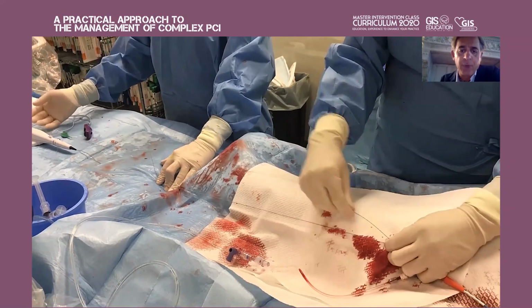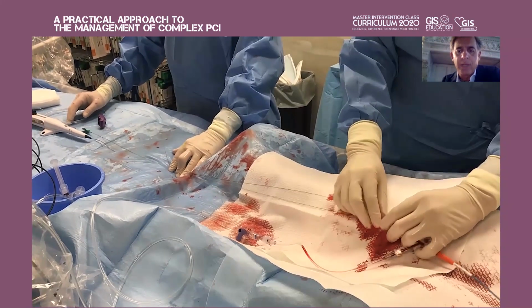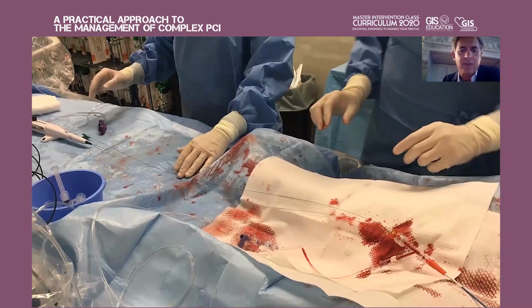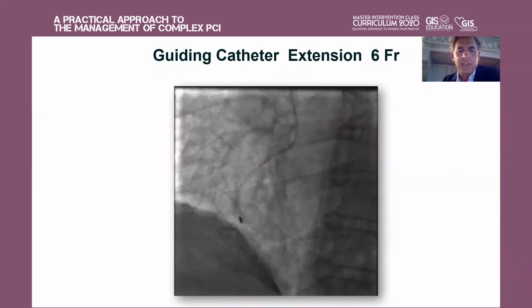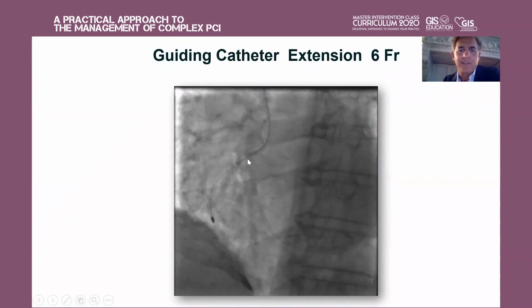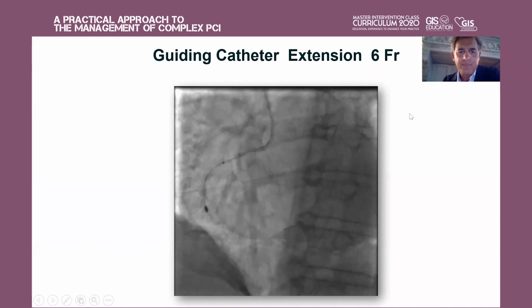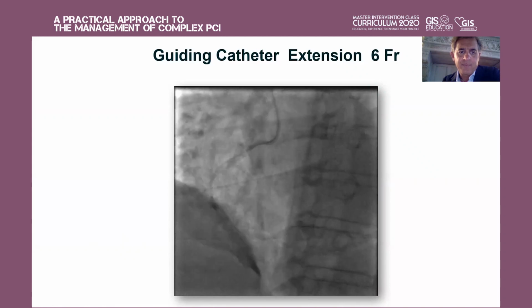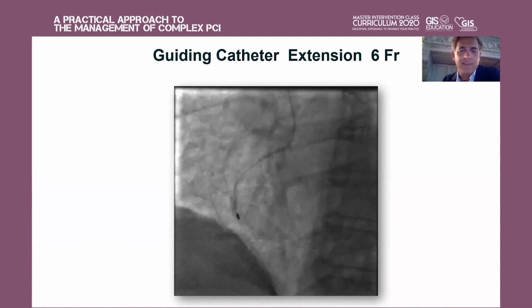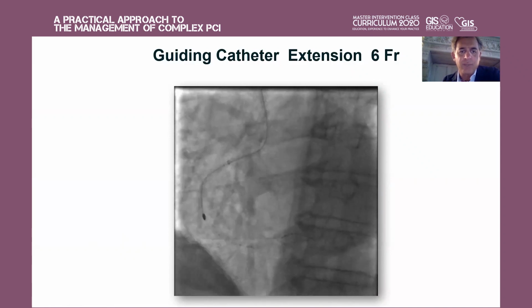And you know, the Burr is entrapped in the artery, so you have a very strong support. You can push, it is a sort of distal anchoring. You see, the Burr is entrapped, and you can push your guide extension in front of the Burr. You can see it's easy because the Burr is blocked in the artery, so you can push easily.